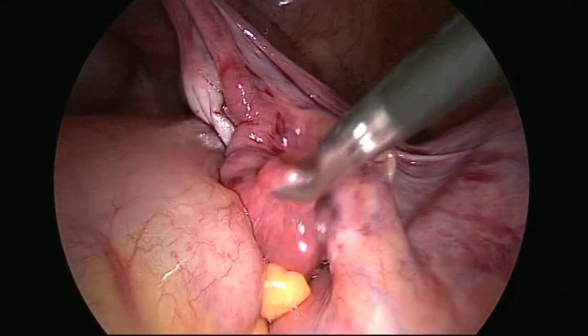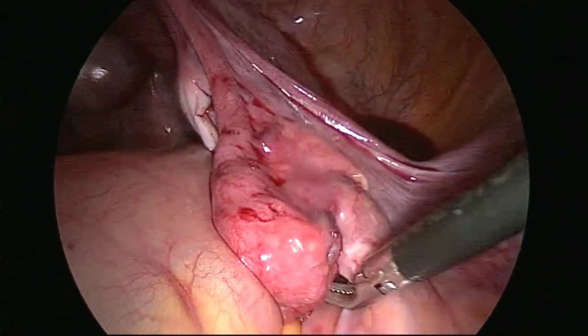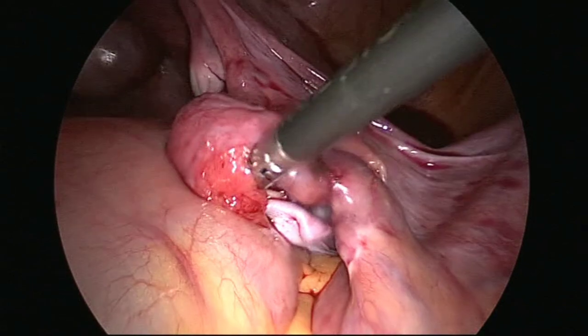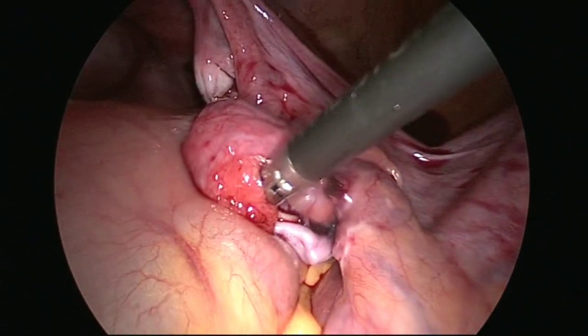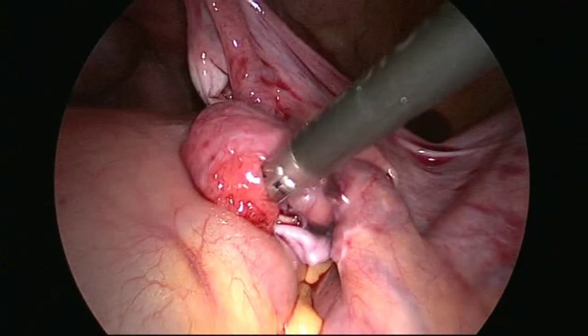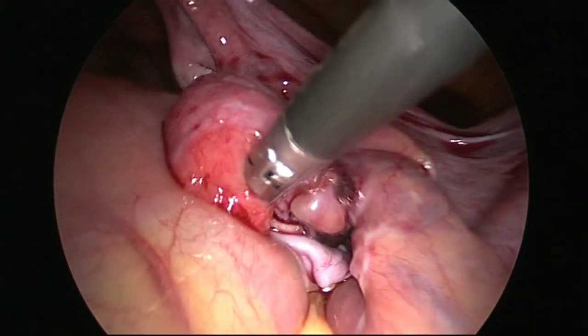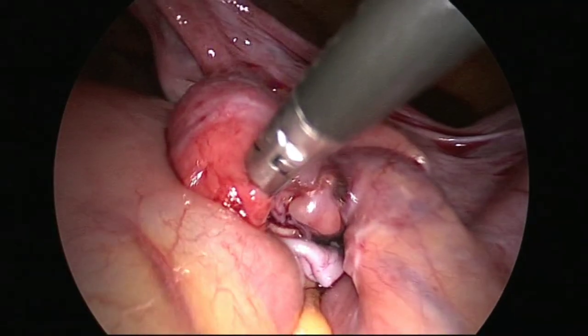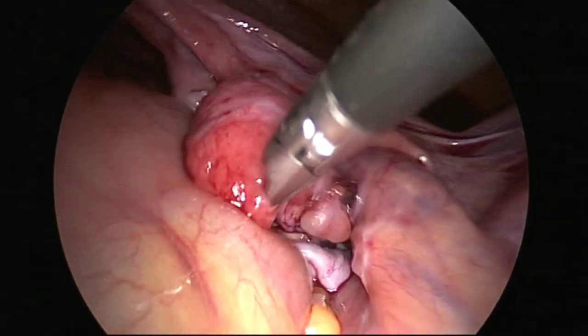We'll see the fimbrial end. Yes, this is the fimbrial end. Now pushing again. Dye is not coming at all, so this side tube is blocked. One side is open and the right side is blocked.